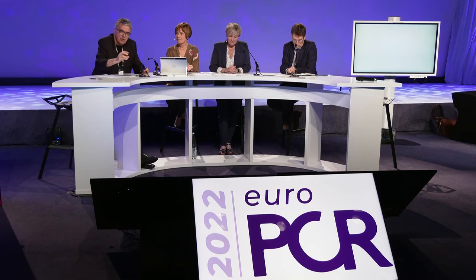So, Jean, do you use rotational angiography in the diagnostic coronary angiography? Yes, I try to use it in a patient with really poor renal function. What we try to do in order to reduce the total dose of contrast is to use this kind of angiography. It's interesting for the patient, particularly at high risk for renal failure. Second, we must not hesitate to use a high dose of contrast. In other words, we are doing a single run, but with a high dose, in order to have a good angiography, a good print of your artery on the screen, in the different views from the beginning to the end of the rotation. But I think it's really interesting.